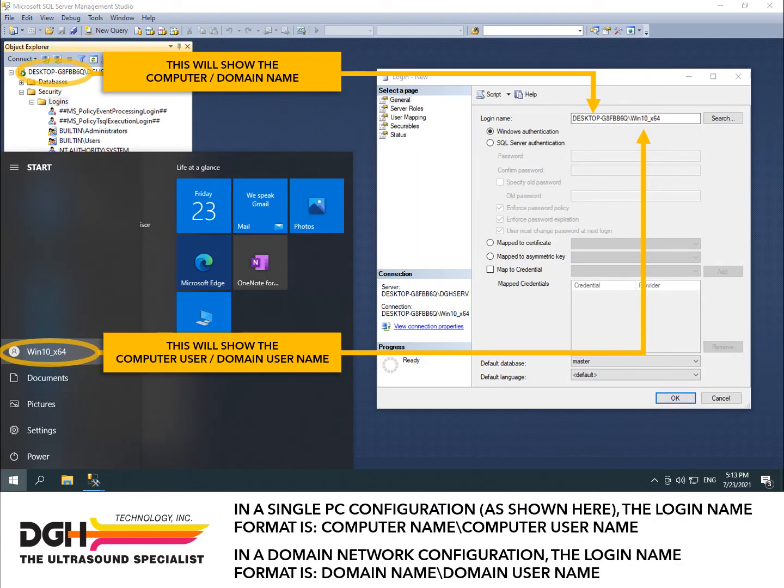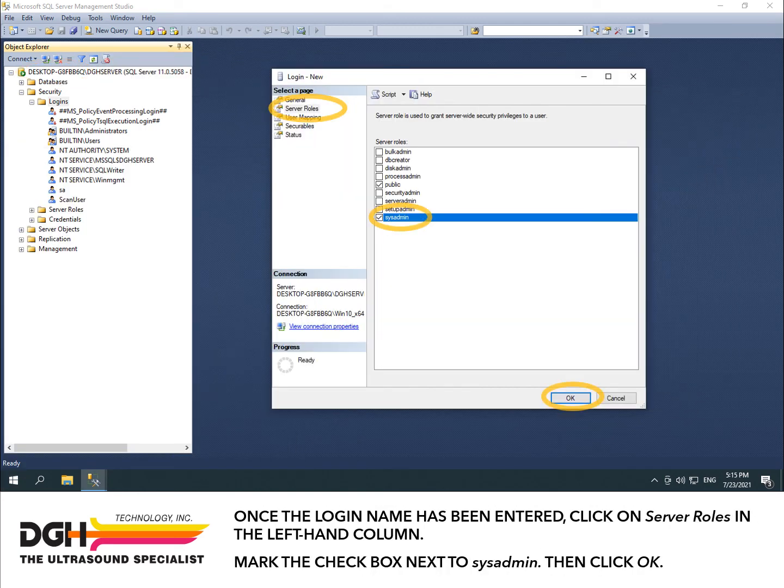In a single PC configuration, as shown here, the login name format is computer name / computer username. In a domain network configuration, the login name format is domain name / domain username. Once the login name has been entered, click on Server Roles in the left-hand column. Mark the checkbox next to sysadmin, then click OK.